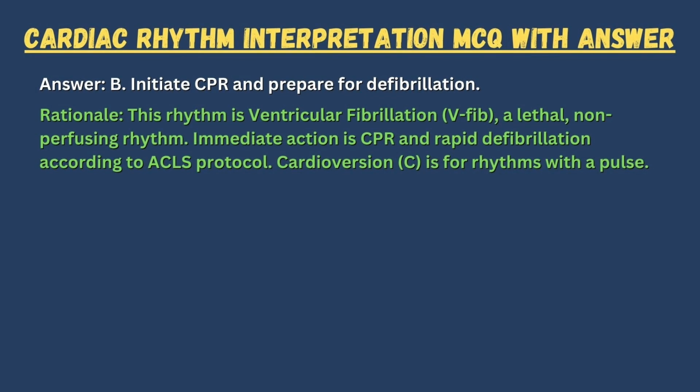Answer. B. Initiate CPR and prepare for defibrillation. Rationale. This rhythm is ventricular fibrillation, V-Fib, a lethal, non-perfusing rhythm. Immediate action is CPR and rapid defibrillation according to ACLS protocol. Cardioversion, C, is for rhythms with a pulse.